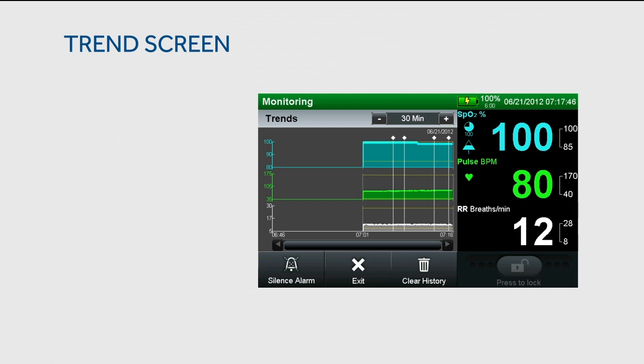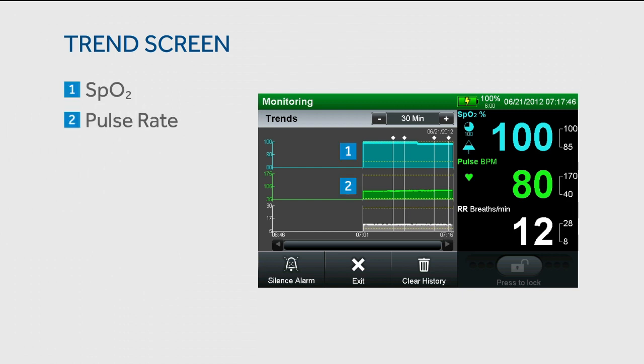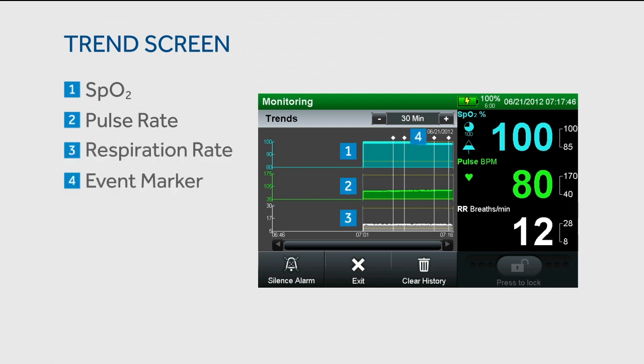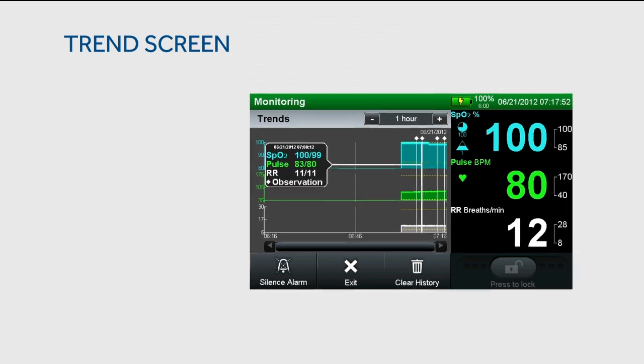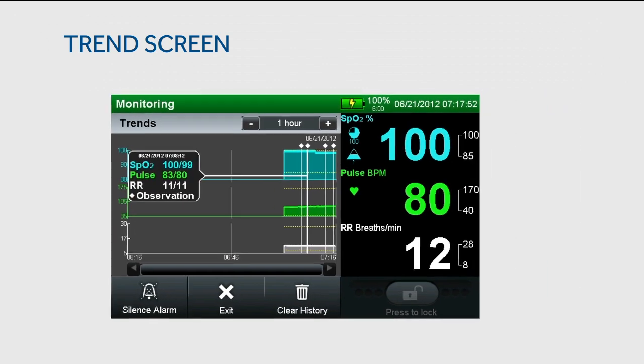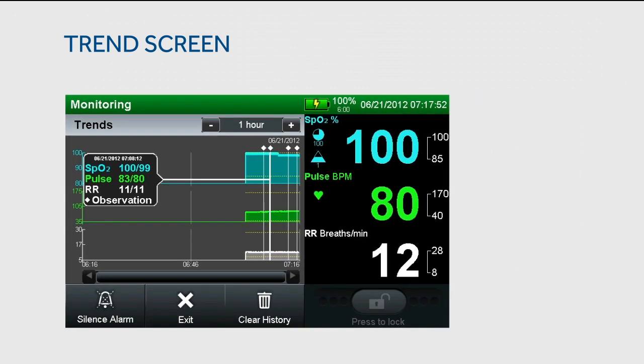Users have the ability to modify the time scale for SpO2, pulse rate, respiration rate, and event markers. By pressing on the main trend screen, you can view a trend review pop-up for a specific instance.